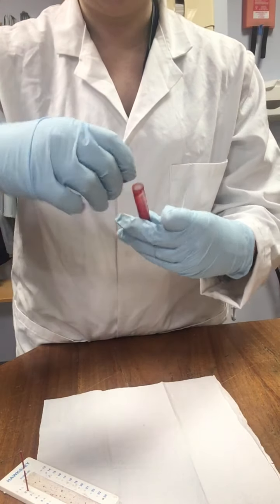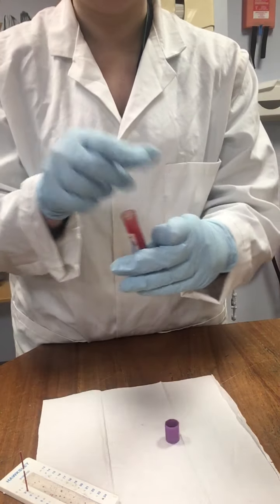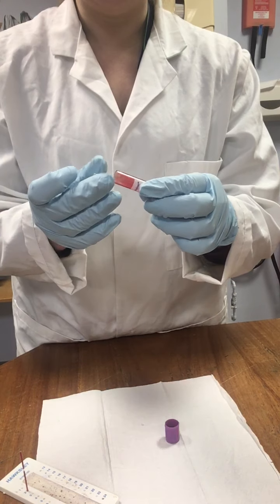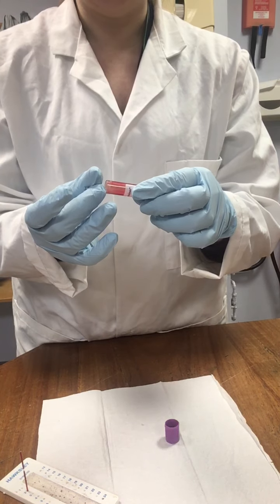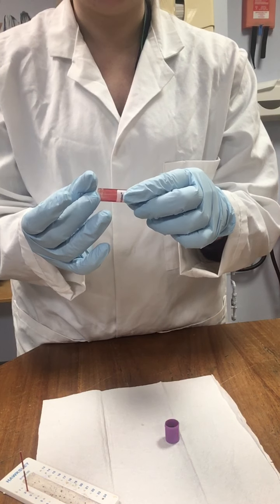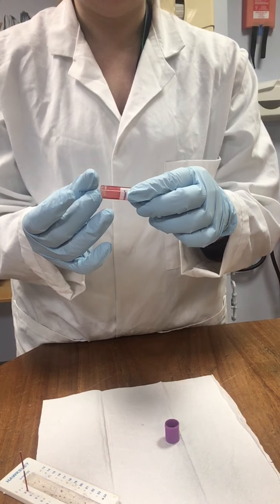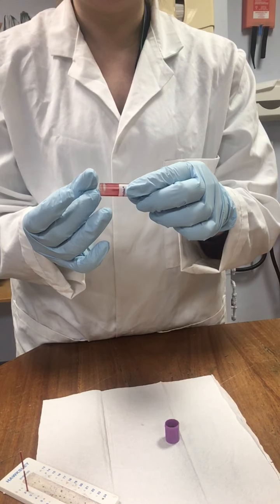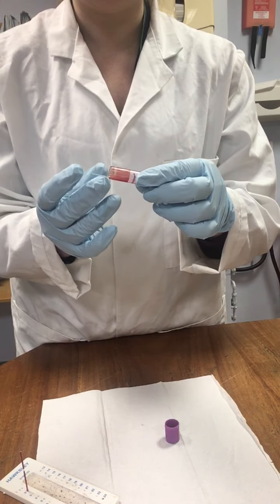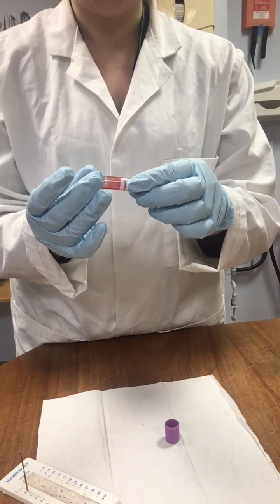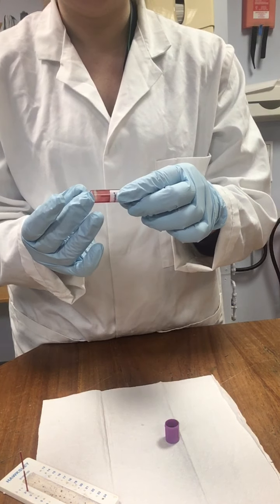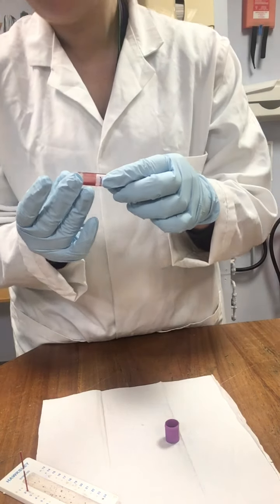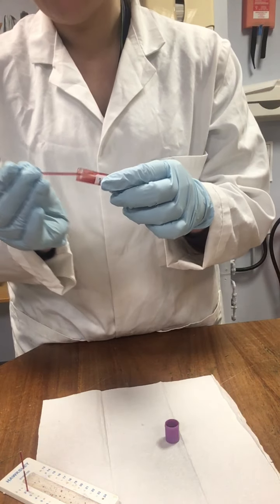So, taking the lid off the sample, again, be careful not to contaminate yourself or your workbench. We're going to place it into our blood tube and just wait a little bit of time, but it's relatively quick for our blood to migrate up the tube. A couple more seconds. It's coming up nicely. There we go.